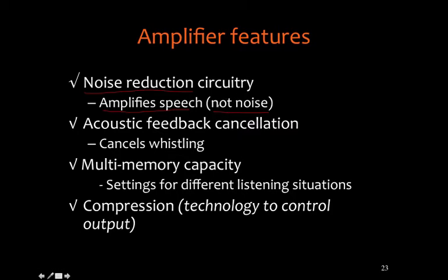Now, when the background noise is not speech, hearing aids can do a reasonable job at preserving the speech energy, but not amplifying the background noise if it's not speech.